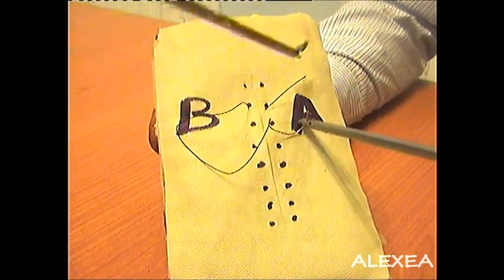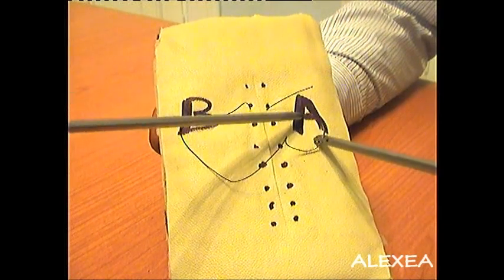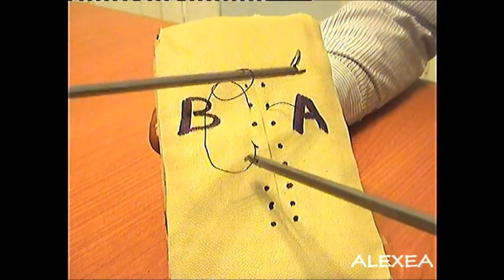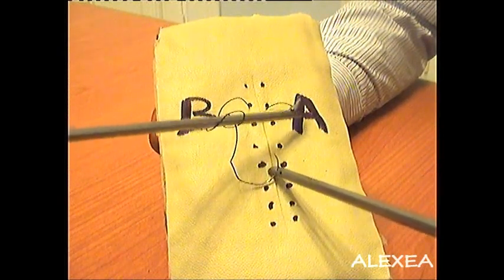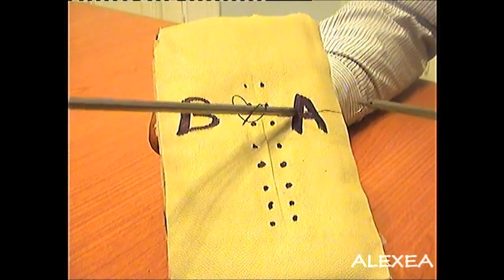Take this needle tip nearest to the short end. Put your non-dominant hand and now take stitch number 1 and pull it away from the tip of the instrument. Stitch number 2, take it away from the instrument, and now the short end is ready to be clamped. Gently release the knot.